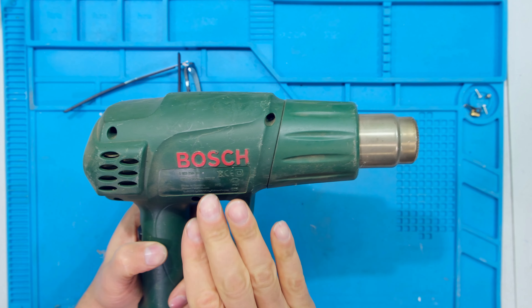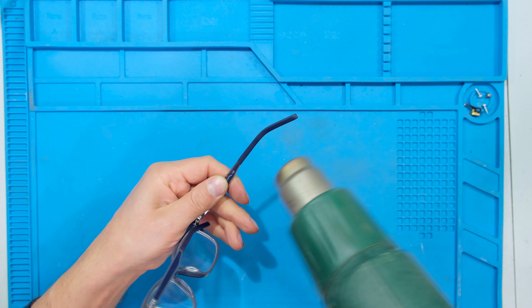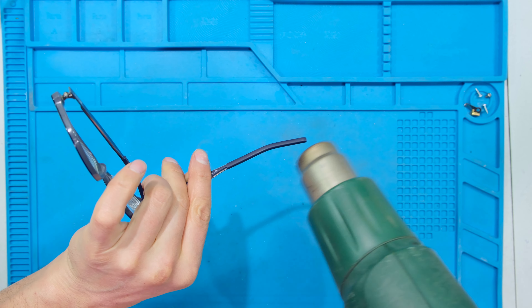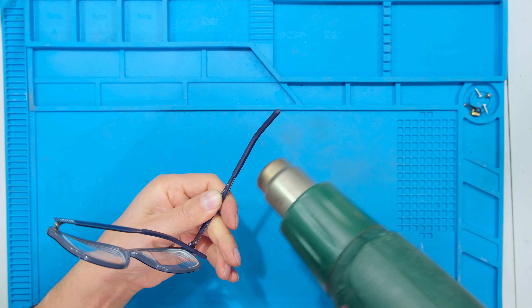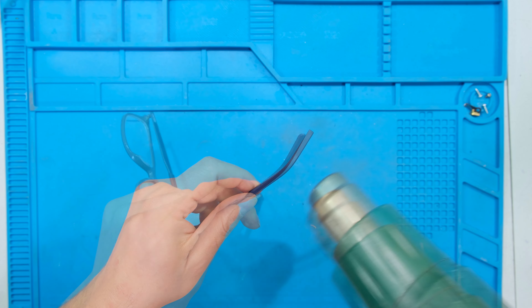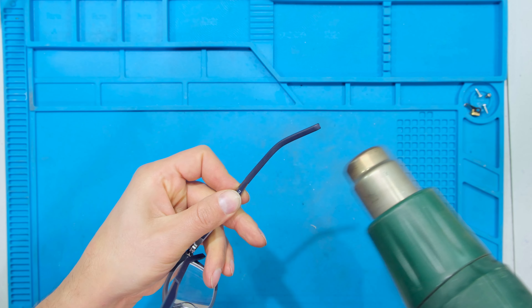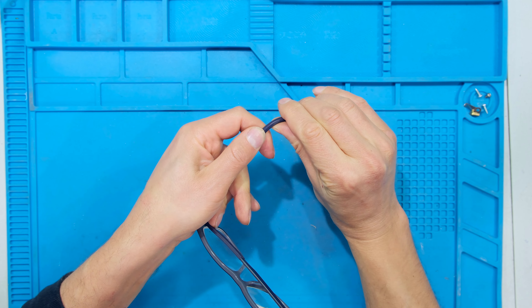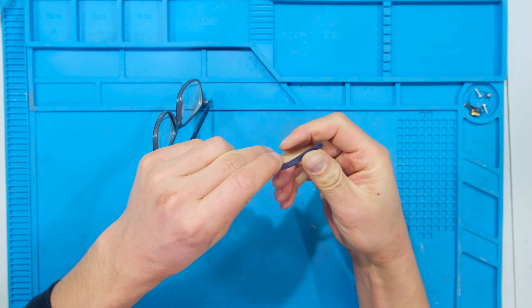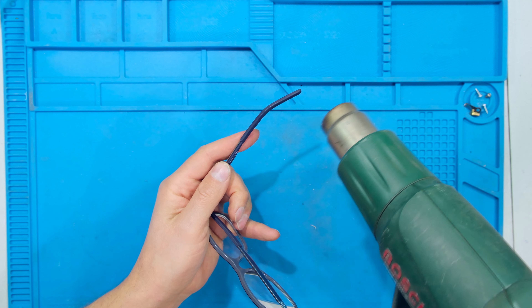The heat gun is now warm — I've set it to the lowest setting. I'm heating it up, and notice that I never let the heat gun stay in one place; I keep rotating the temple and I also never touch the heat gun onto the temple. I'll just do a quick test — it's not that hot yet. Now it is quite warm, I can feel it warm in my hand — not so much that it would burn me — and I'm bending this inwards and down. Just do a little bit more.